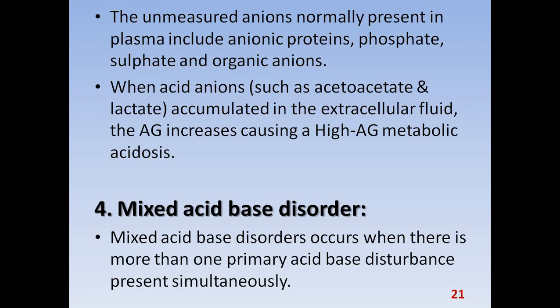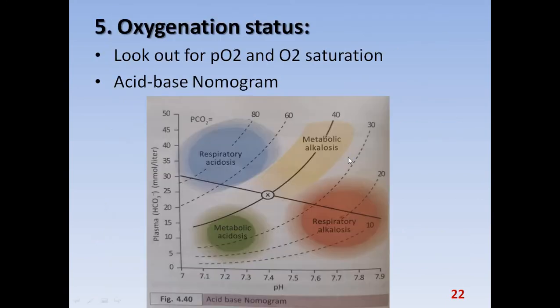These mixed acid-base disturbances are usually seen in critically ill patients in intensive care units, and also in the elderly. So next we'll go for oxygenation status.